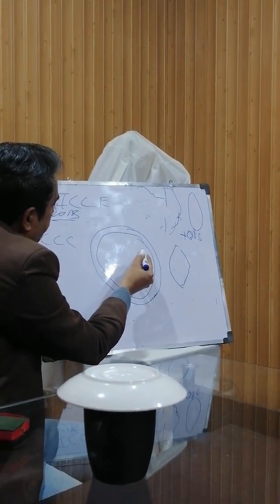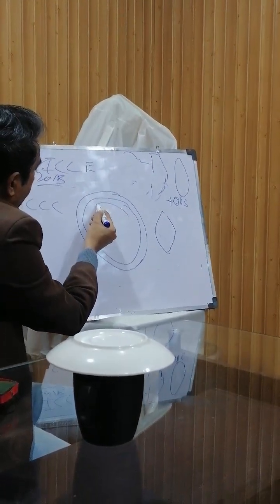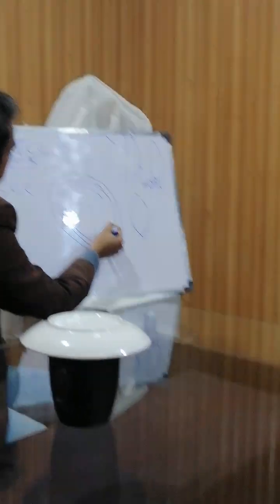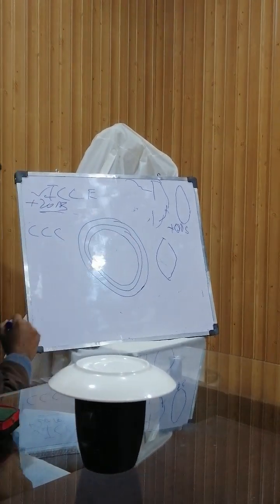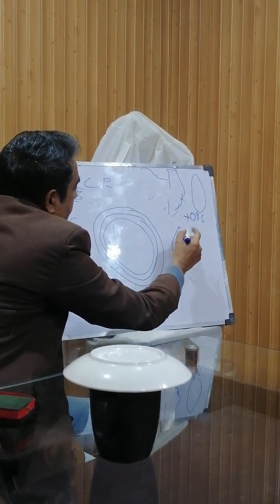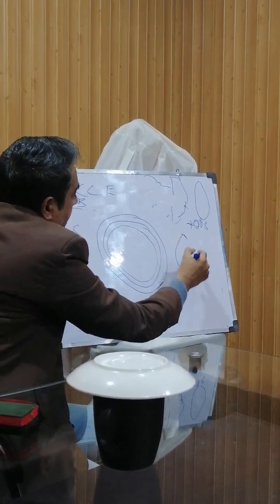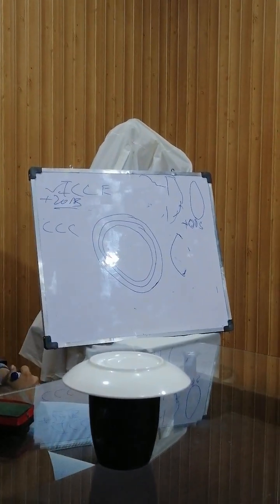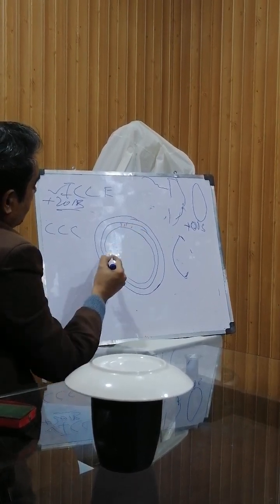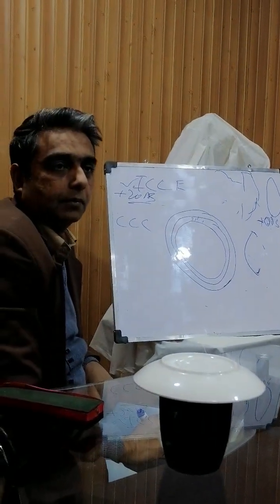But this needs a lot of practice. We remove the anterior capsule continuously, and it is continuous curvilinear capsulorhexis. Now the anterior capsule is removed, but in a special fashion. Here the things which I have left are the parts of the anterior capsule, because we have not removed all the anterior capsule. This anterior capsule is still there. So we have the bag of the lens. Are you getting my point?